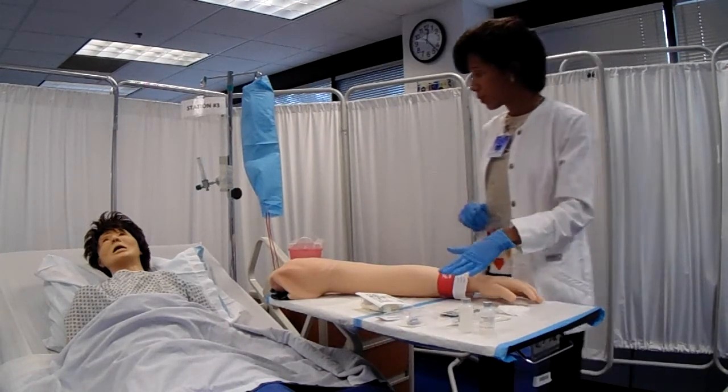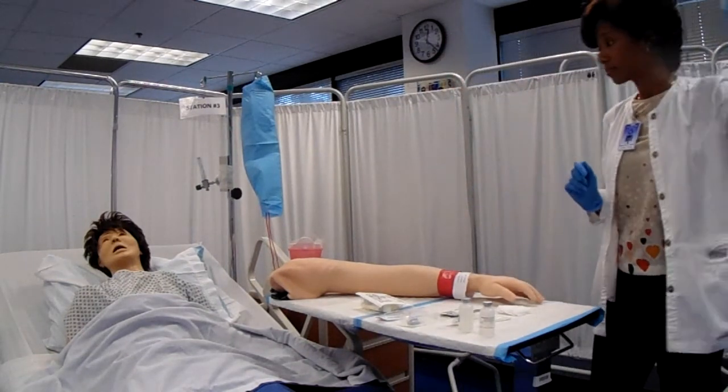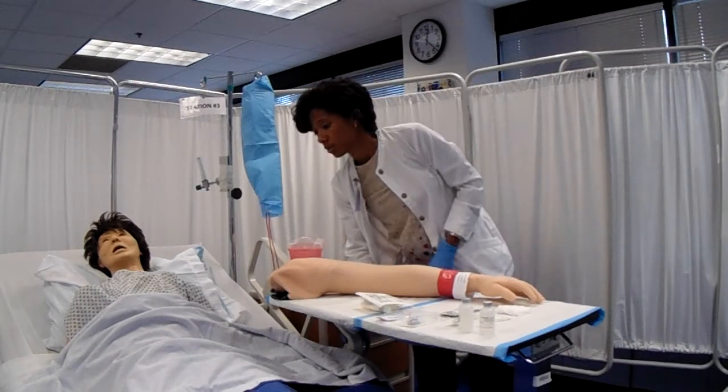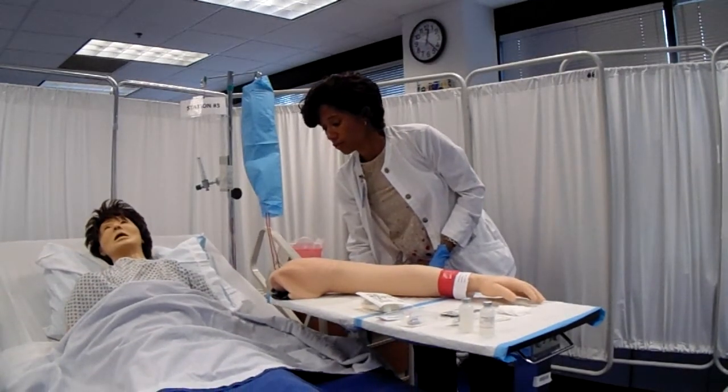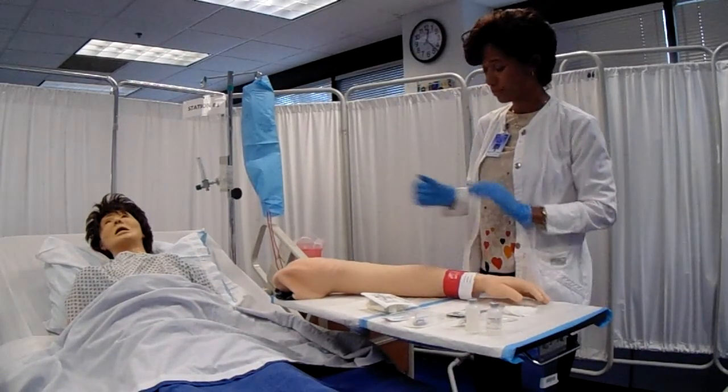I gathered all my equipment to start the IV, but first I'm going to provide privacy. And I'm going to go ahead and reposition your bed to provide for good body mechanics on my part. Let me know if at any time you're uncomfortable.